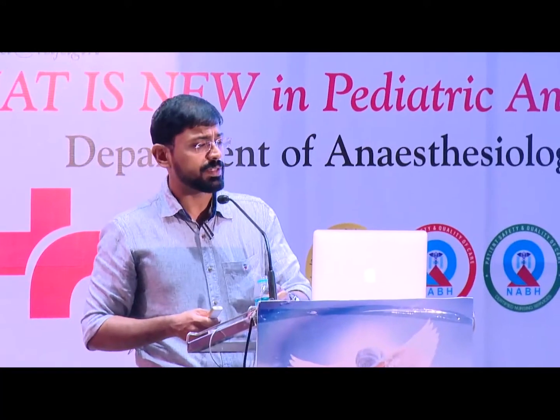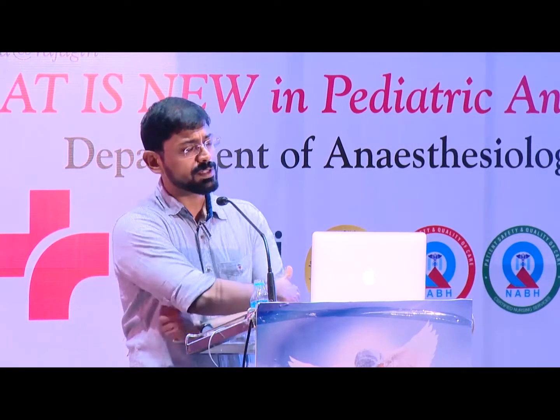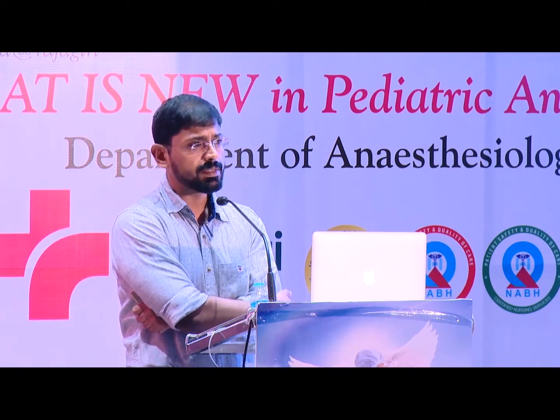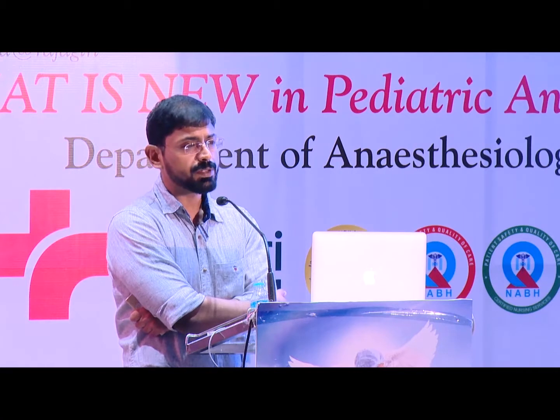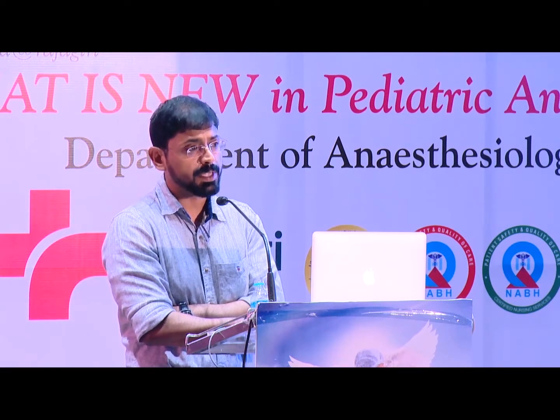Why did we start on a rate of 45 per minute? We could start with any rate, to be frank. The normal physiological rate is between 30 to 60 per minute. Now, his lungs are fairly normal. He didn't need any respiratory support to start with. So if I would have given him a rate of 60, delivering those pressures, we anticipate that that would cause a washout. Now, it's not good to give a low CO2 for a baby. Ideally, a rate of 30 to 35 would have sufficed. But then because we sedated and paralyzed him for the purpose of surgery, the baby will not be taking any respiratory efforts. So a fairly safe range to start with would be about 40 to 45 per minute.